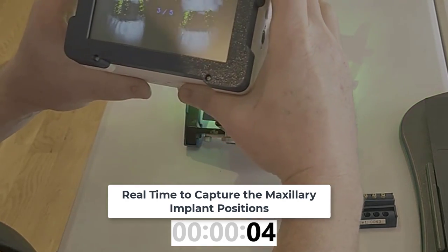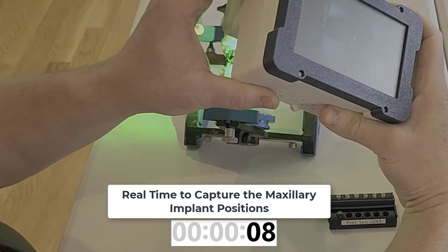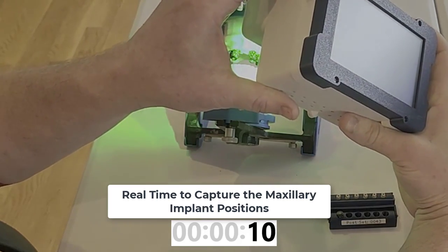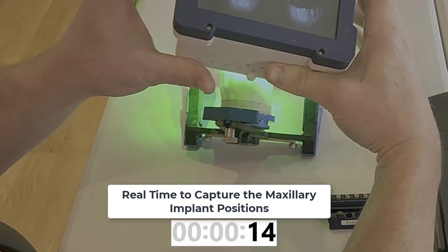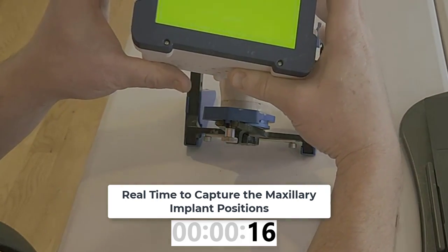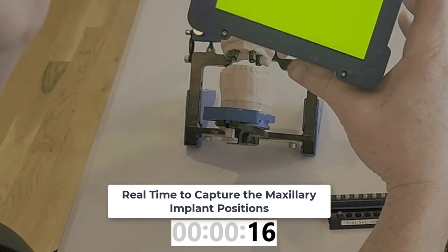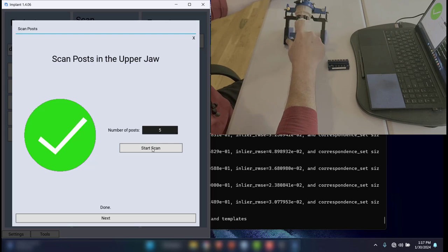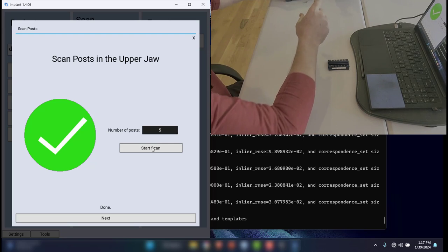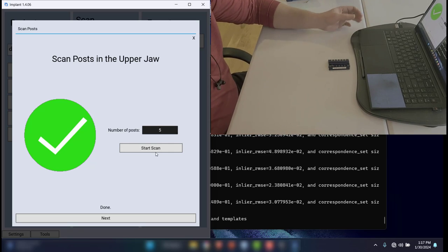And as I capture them, you will hear that ding happen. All right, the software is picking all of those up. I've got 4 out of 5, 5 out of 5. As soon as it captures enough data, it just shuts itself down. You're done. And that's it. So now you've captured your implant positions. All that can go to the side. That data is being transmitted to the software wirelessly.